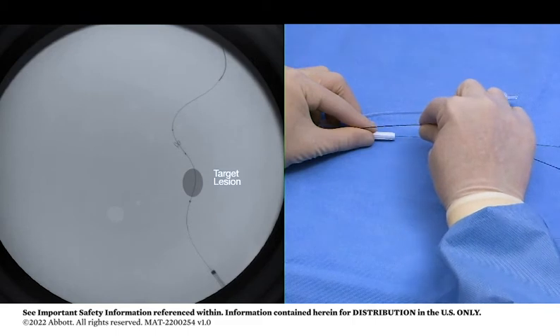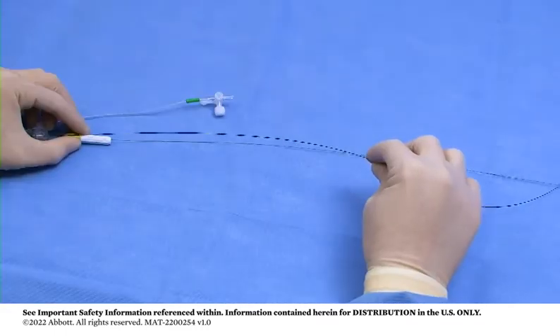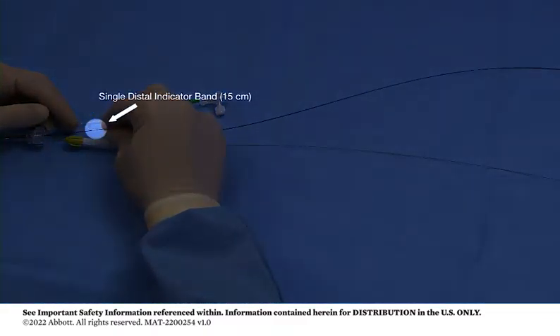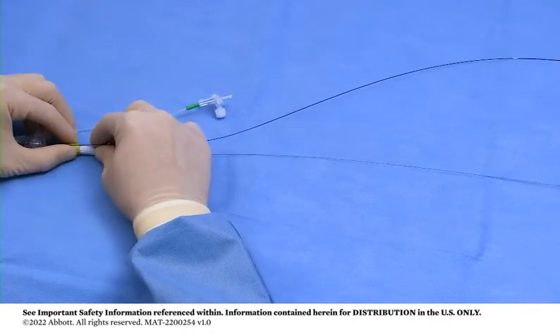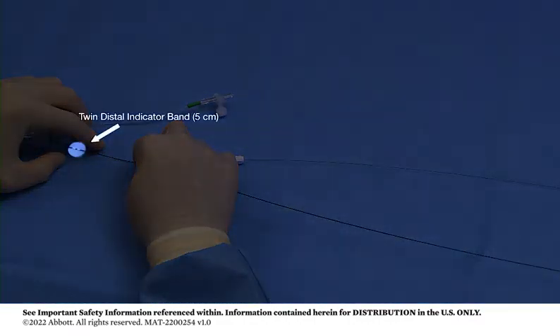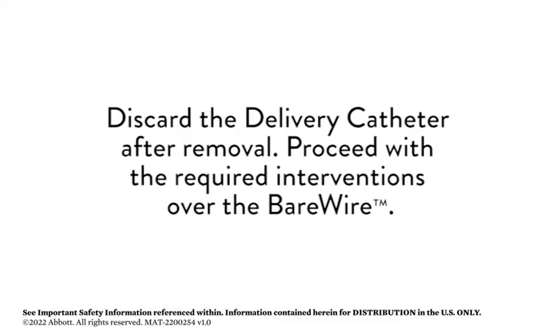Maintain bare wire position and remove the delivery catheter. Notice the single distal indicator band is positioned 15 cm from the Rapid Exchange exit port, and the twin distal indicator bands are located 5 cm from the Rapid Exchange exit port to aid catheter retrieval. Open the hemostasis valve after the twin distal indicator bands become visible. Discard the delivery catheter after removal. Proceed with the required interventions over the bare wire.